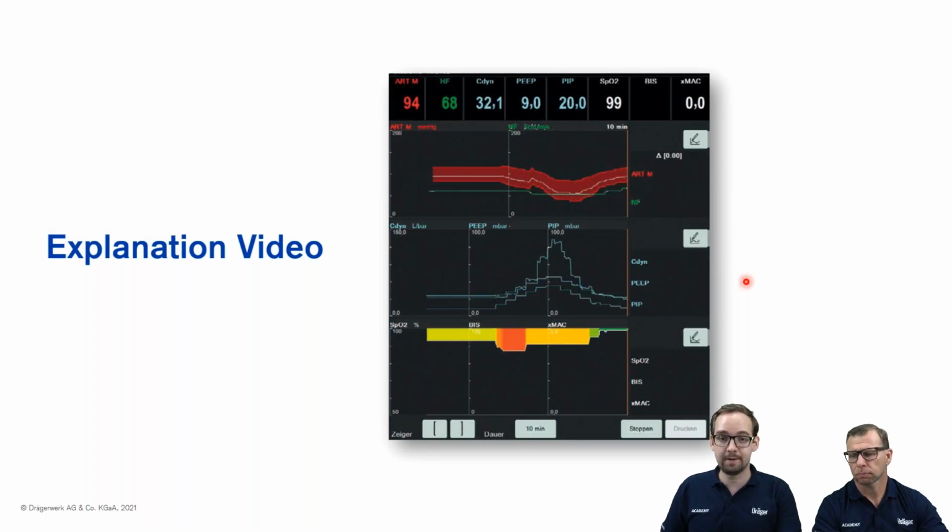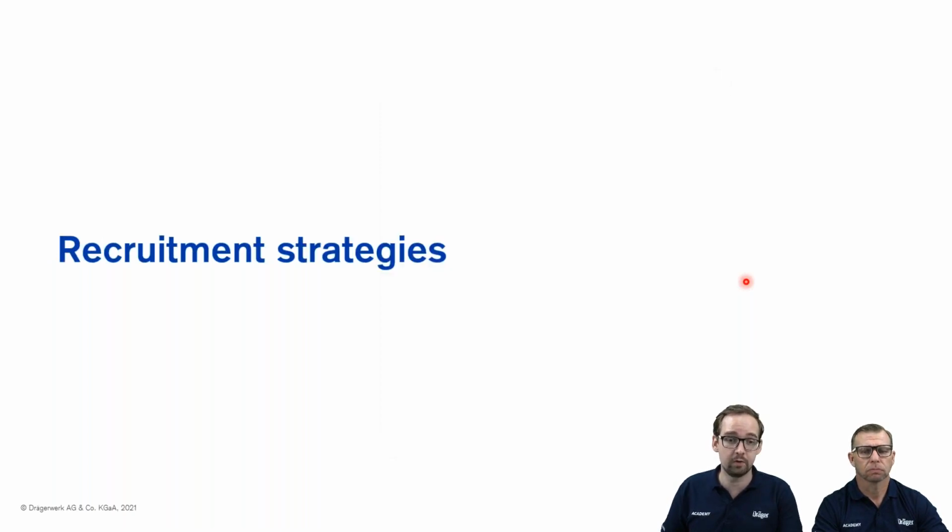Thank you, Craig. So as we can see, we want to do lung recruitment safely, to make sure we only do this in patients who are responding well. This is one way to ensure your patient safety when doing lung recruitment.